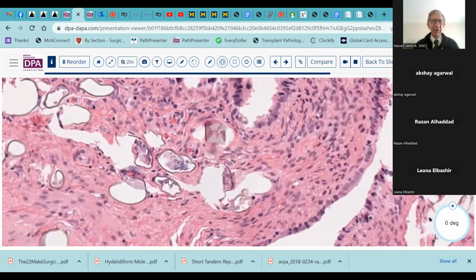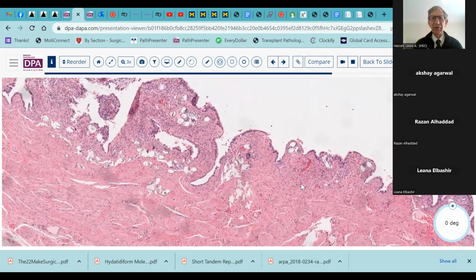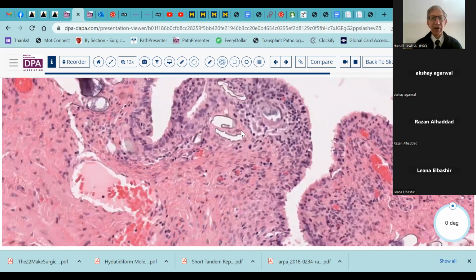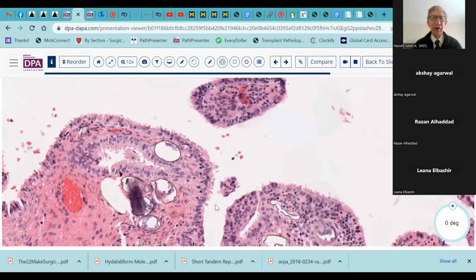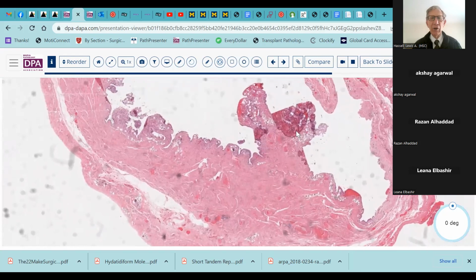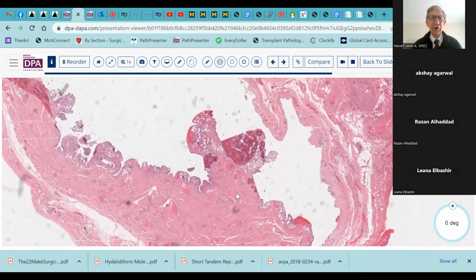And so we don't really see, I think, the truly diagnostic features of this specific egg. But I believe this patient was of Middle Eastern origin and had schistosoma in other organs, and just happened to have this as an incidental finding in a salpingectomy removed for other disease. So no viable eggs remaining here. It's probably been very long standing, but illustrates the fact that parasites don't always know the right vessels to get into in terms of reproduction.